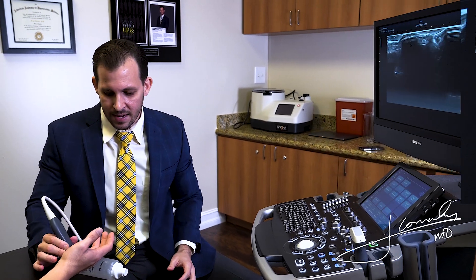Again, a very easy assessment and diagnosis in the office with ultrasound — a non-invasive way of diagnosing trigger finger. Thank you, hope you guys enjoyed the video.